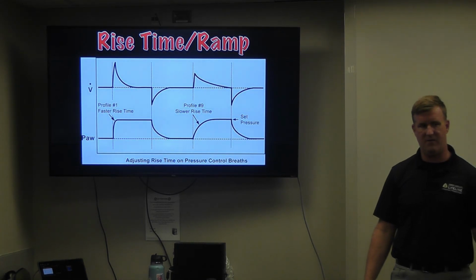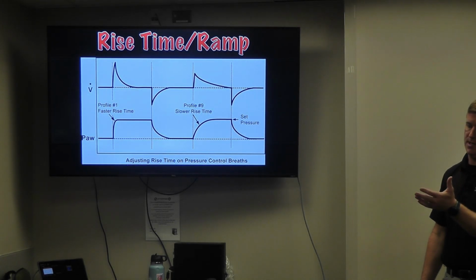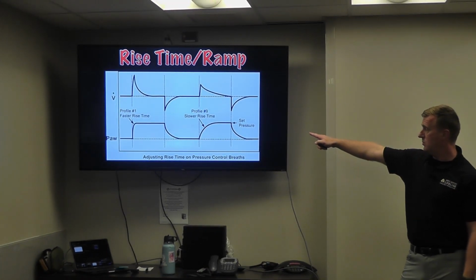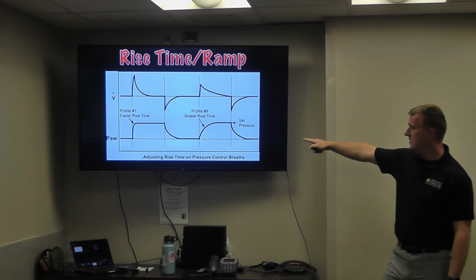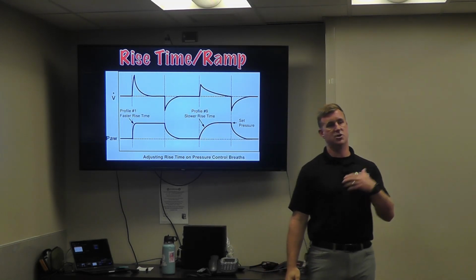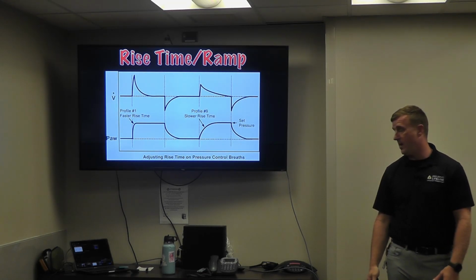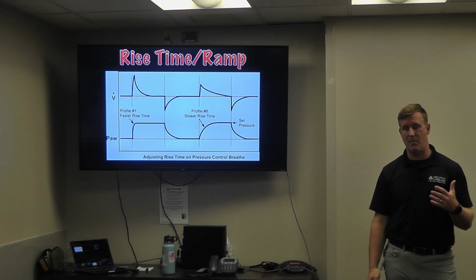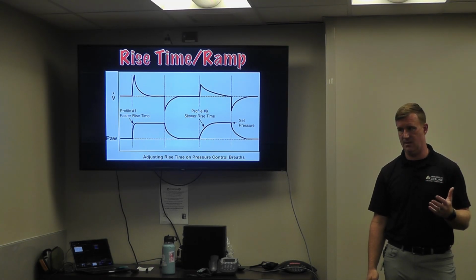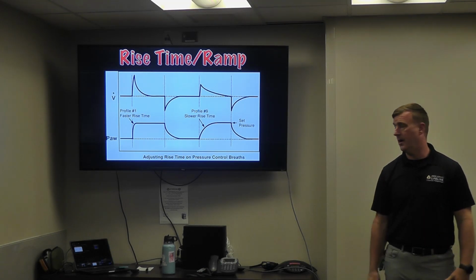It's typically a profile of around 25 to 50 milliseconds. That's how the T1 defines it, in milliseconds, an actual time. And then you have rise profile 9, where I trigger my breath and we get a slow rise. So it's much slower on the front end. If I remember right, that equates to a ramp time of about 700 milliseconds. So pretty slow, right? Over half a second from start of the breath to full pressure.